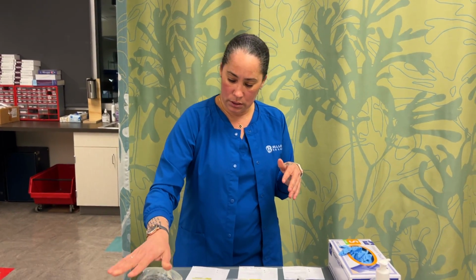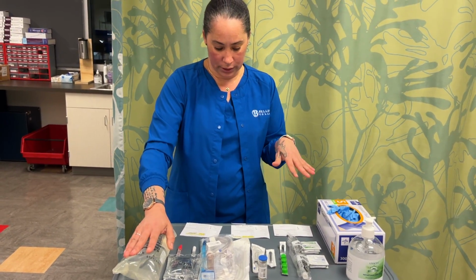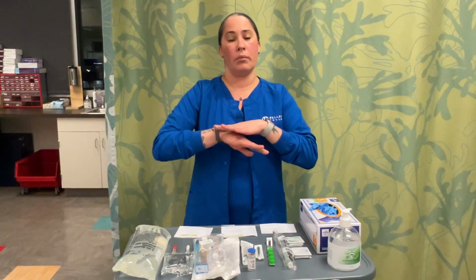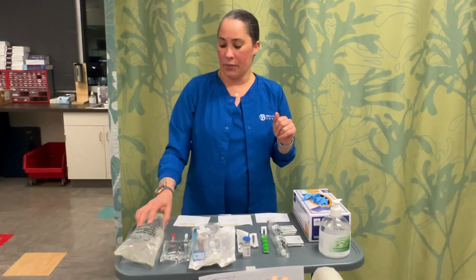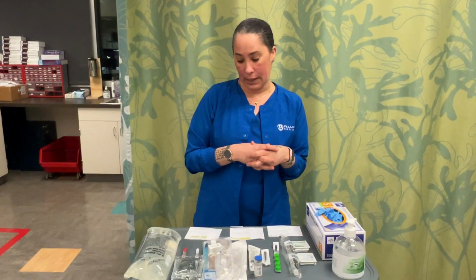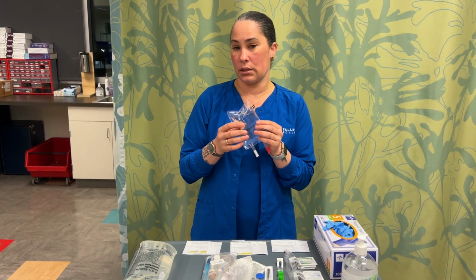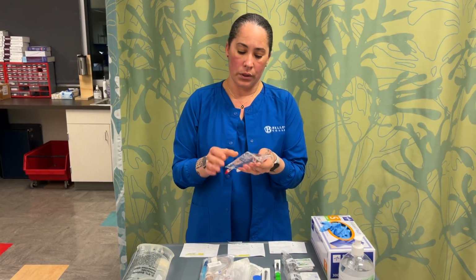The second thing they're going to get today is the sodium chloride. And so this is just going to be for hydration and electrolyte balance, just to make sure that their electrolytes don't get all imbalanced. The patient does have a UTI, so they are also ordered some antibiotic, which is ciprofloxacin. And so we're going to give this to the patient.